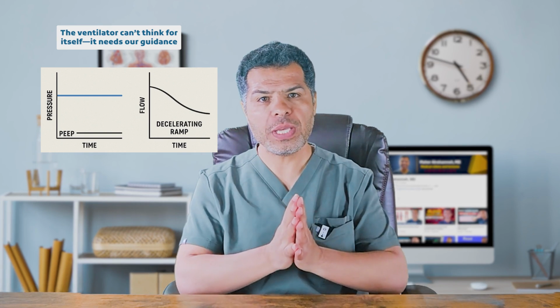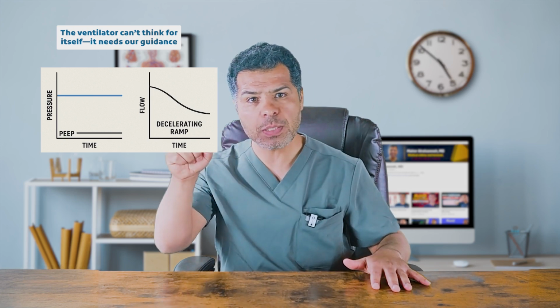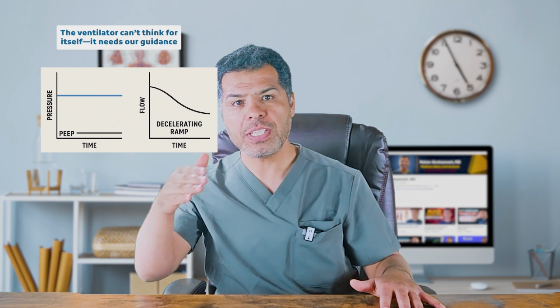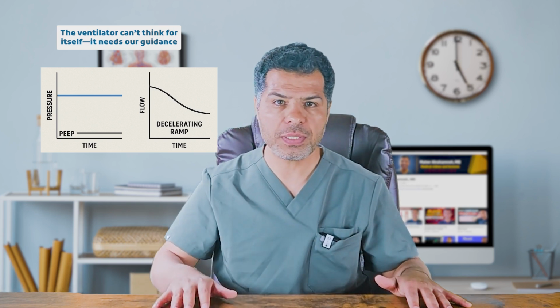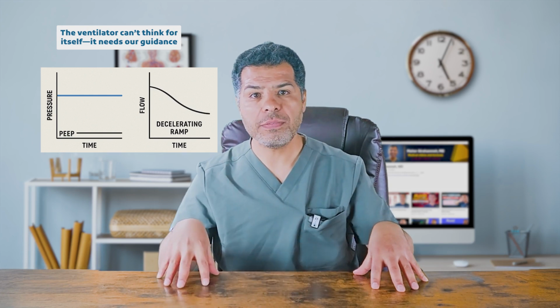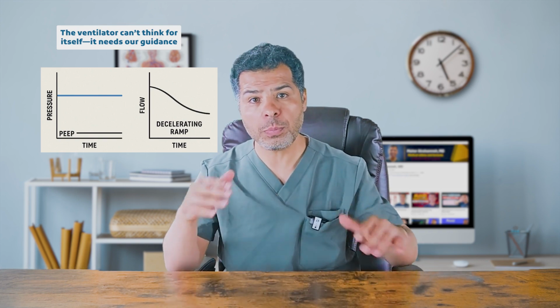So what do you think the flow pattern will be in pressure target? To maintain a fixed pressure throughout the inspiratory phase, the flow must progressively decrease to keep the equation valid. Remember the equation: flow equals PIP minus alveolar pressure divided by resistance, of course, as long as the resistance is constant. That's why the flow versus time curve is always a decelerating ramp curve shape in pressure target modes.